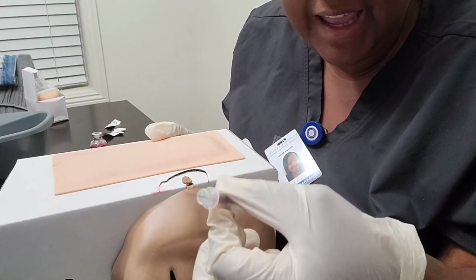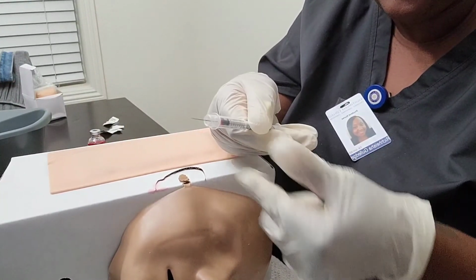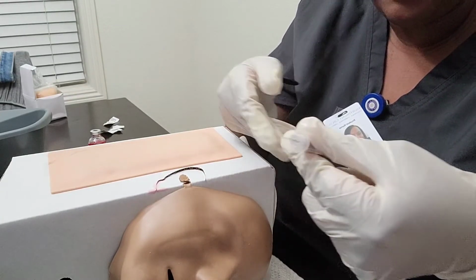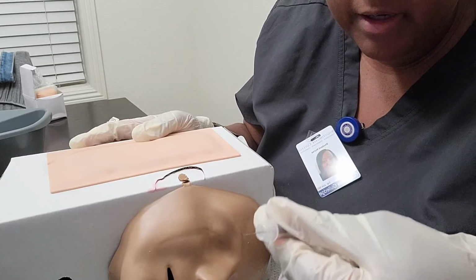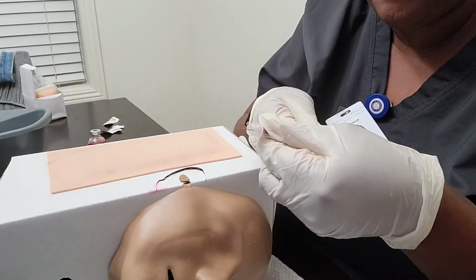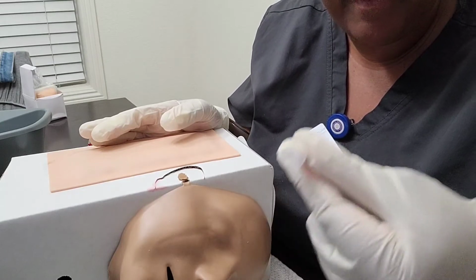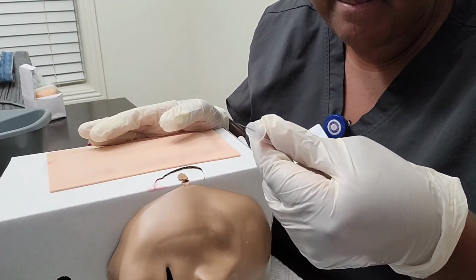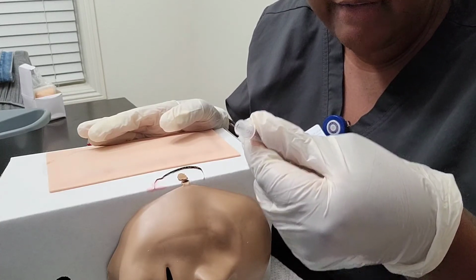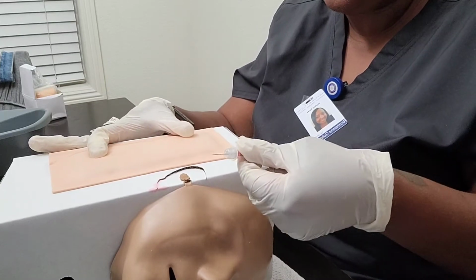With my dominant hand, I will hold the needle with my thumb and forefinger like this, and then I will make sure that the bevel part is facing up. With my non-dominant hand, I will stretch the skin.